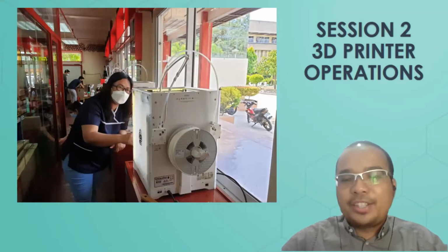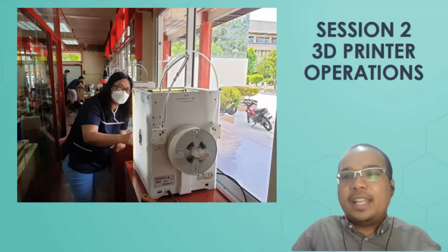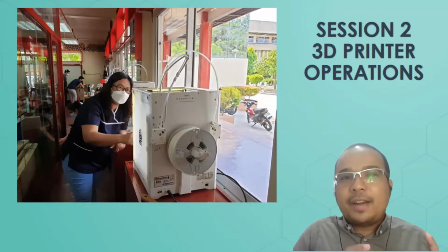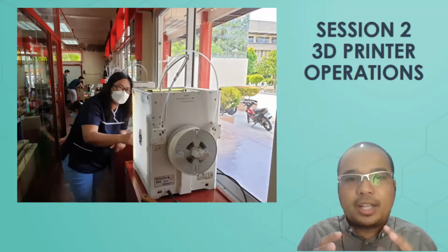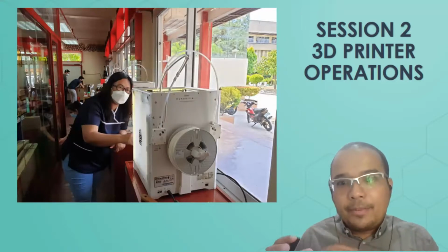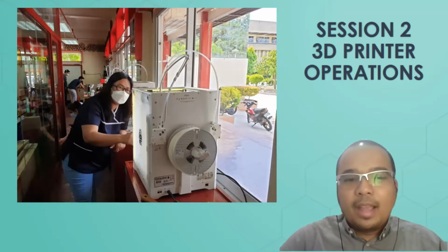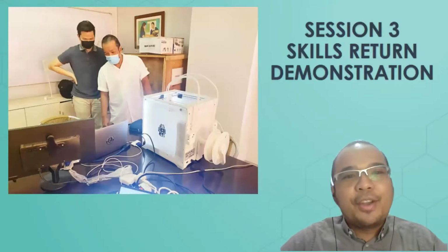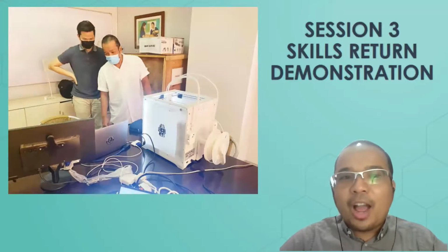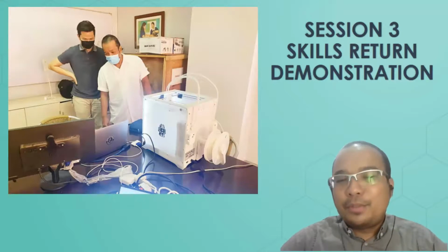So now that they're done with the entire process of converting the DICOM file into an STL file, modifying the STL file based on how they want a surgical guide to look, converting the STL file into a machine readable file, and the actual use of 3D printers. On our third session, we had our skills return demonstration, by which we allowed our trainees to exhibit those skills and do it from womb to tomb.